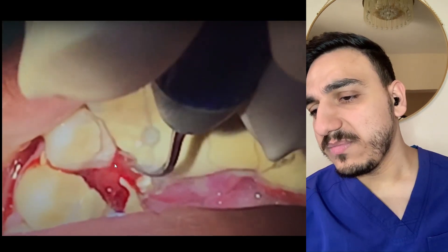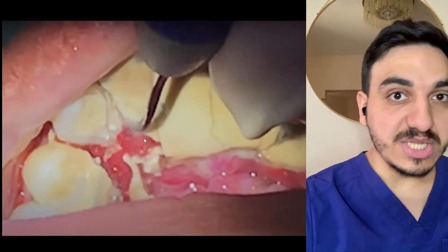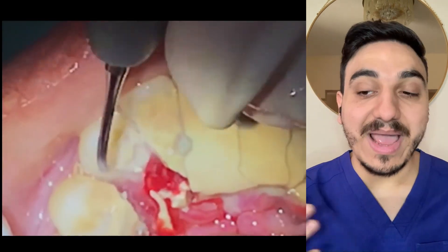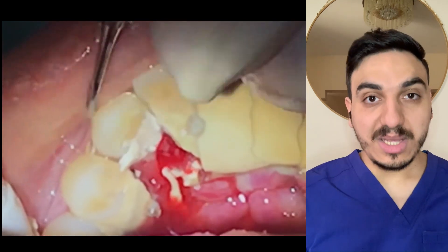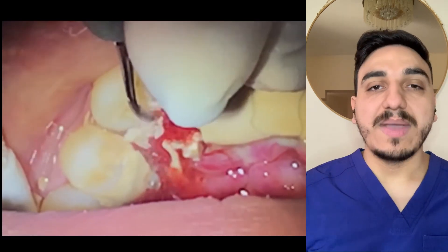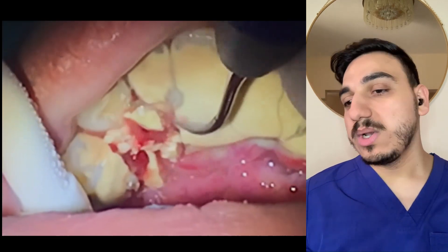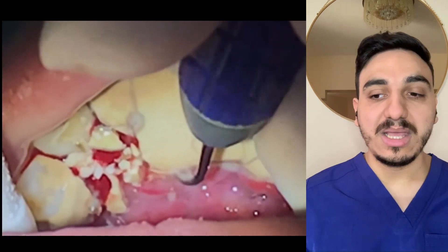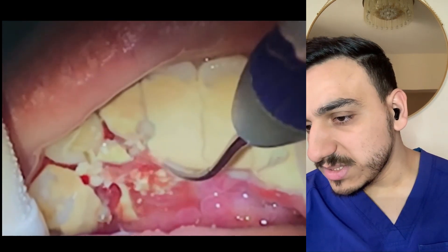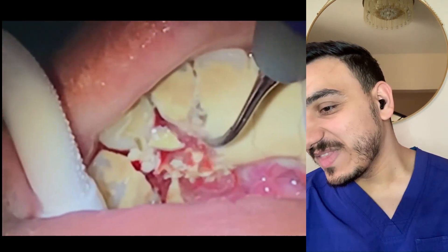If you don't know what this is, this is called an ultrasonic scaler. The reason it has water coming off is to help primarily with cooling, and also to help clean the tooth surface and push the debris away. It's basically used as a coolant method — because we don't want a lot of heat to be generated on the tooth surface.